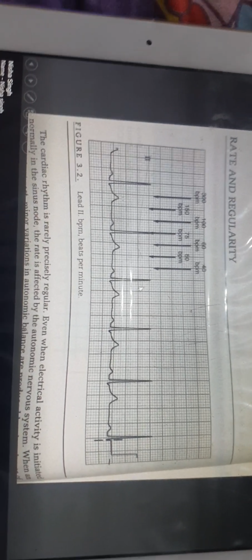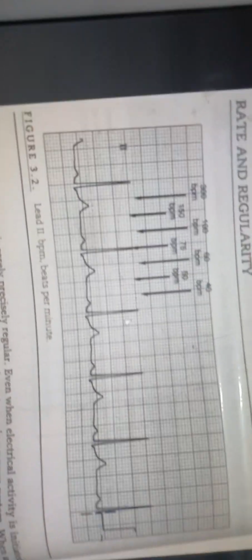Suppose there are only 3 squares between the two RR complexes. There are 3 squares, then the rate will be 300 divided by 3, that is, the rate will be 100.